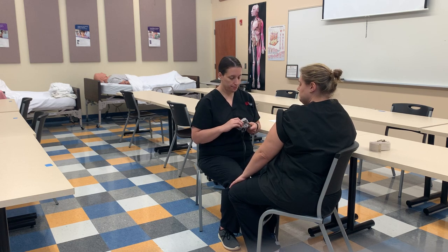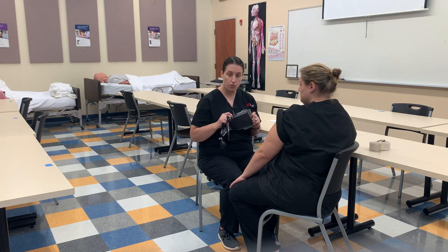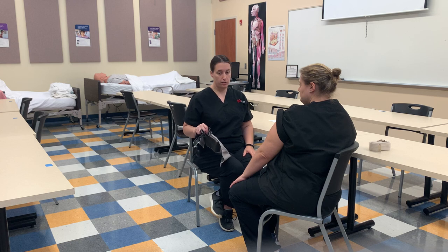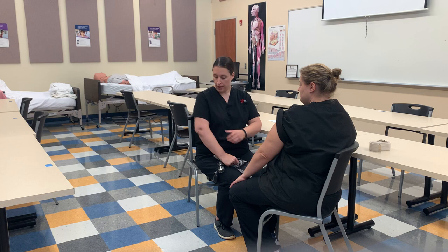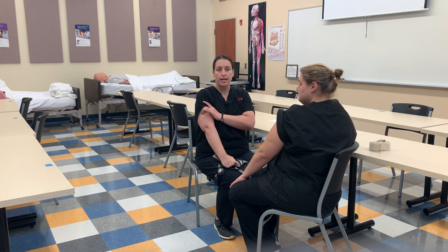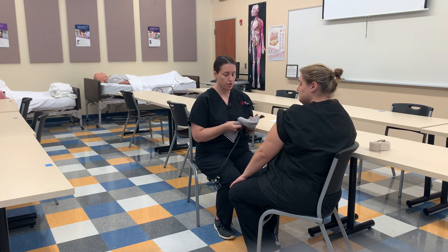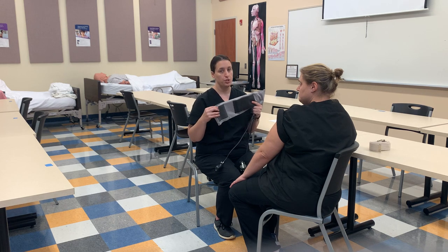Now I'm going to do a blood pressure. You need to make sure you have the right cuff size. Make sure the patient does not have their legs crossed or ankles crossed — that will increase the blood pressure. If they have a long sleeve shirt, you don't want to pull it all the way up because that can add restriction. Either keep it down if it's thin enough, or ask them to remove their sleeve. If the cuff is too small, it'll give too high a reading; if the cuff is too big, they'll get a low blood pressure reading.